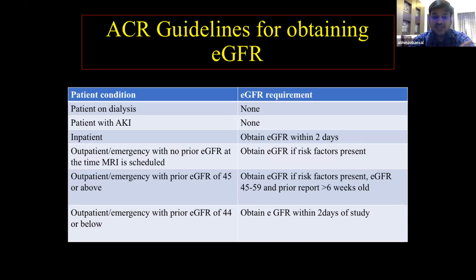For patients who present in the emergency and in the outpatient department, and those who don't have any eGFR estimated prior to the study, we only have to obtain the eGFR if there is presence of some risk factors, which I already talked about, like the patient has diabetes, hypertensive on medication.